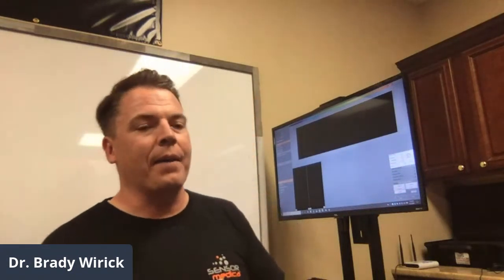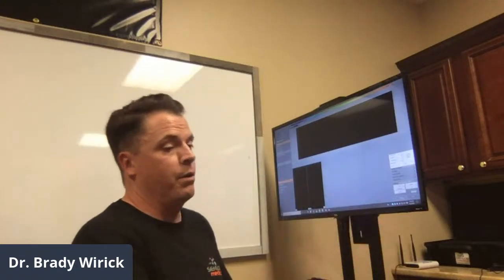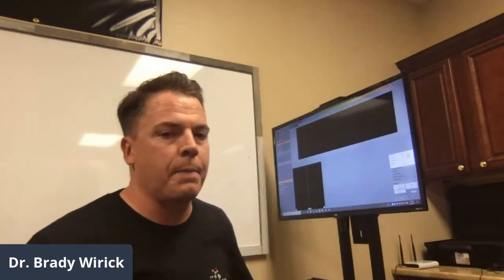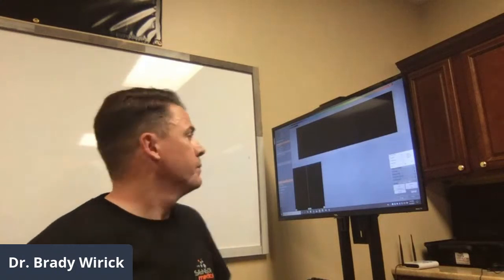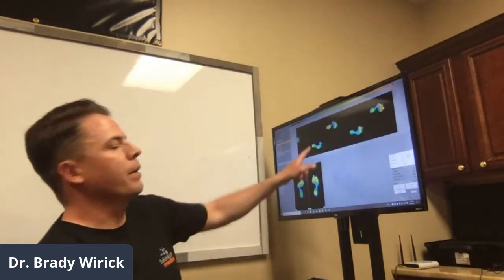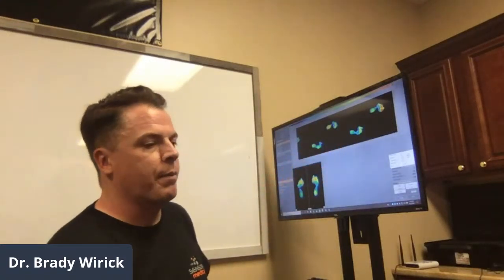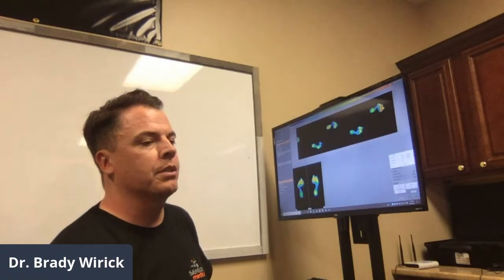So, Pat, I'm ready when you are. If you can just start taking steps across that. Again, you're going to see it's still not doing it. Oh, it's processing it. Okay, there we go. So there are the steps. They just showed up. And I'm going to have you walk back and forth on that a few times. Good.